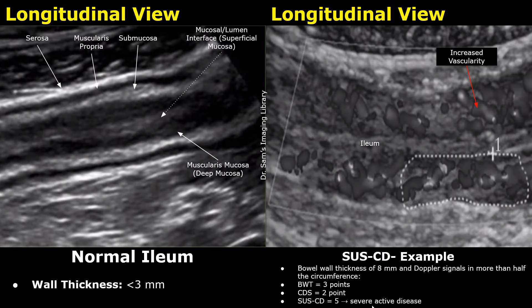Here is another example. In this case, the bowel wall thickness is 8 mm, so it gets 3 points in the bowel wall thickness category, since 3 points are given for 8 mm or greater. There is very strong vascularity seen throughout the bowel wall, so scanning in the transverse plane we would get Doppler signals in more than half the circumference — 2 points in the CDS category. The final score is 3 plus 2 equals 5, the highest possible score, indicating severe active disease.